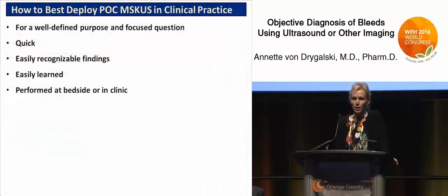So point-of-care ultrasound in hemophilia clinic has to fulfill the same standards as any other point-of-care diagnostic modality. So how to deploy it best is for a well-defined purpose and a focused question. It will not replace a full joint exam. It's quick, with easy, recognizable findings. These findings need to be learned easily, and they should be performed at the bedside or in clinic. If you have to send your patients for any test, not just imaging, to the lab, to a radiology department across the street, and you have to wait for the test results for several days, it's not a point-of-care test.